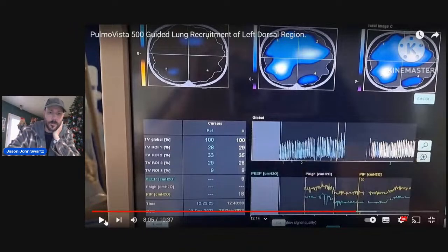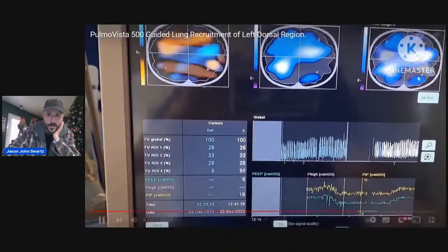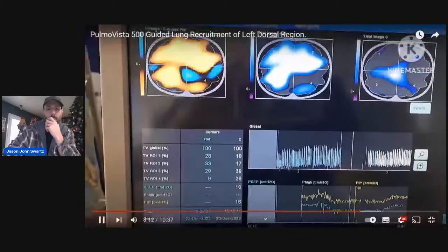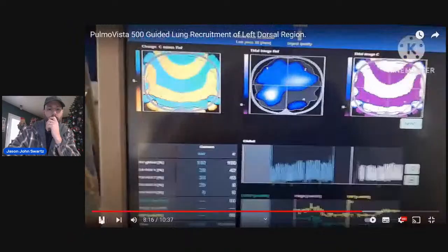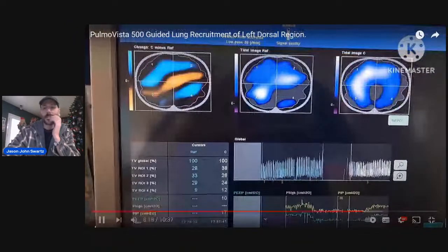But what I'm saying is, already 20 minutes in, more interference. They did an echo, so it kind of opened up at one point. Then they were doing an echo. So anyways, they left the patient and recalibrated. So this is the best look.